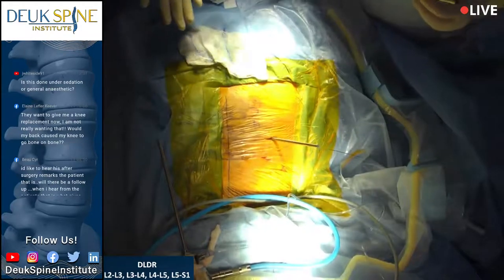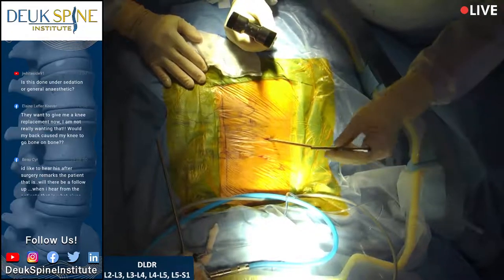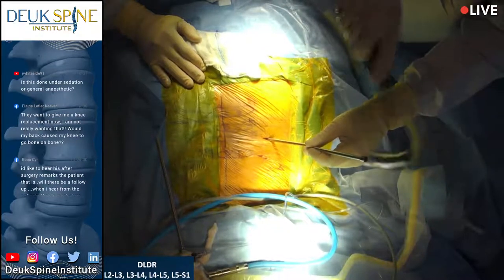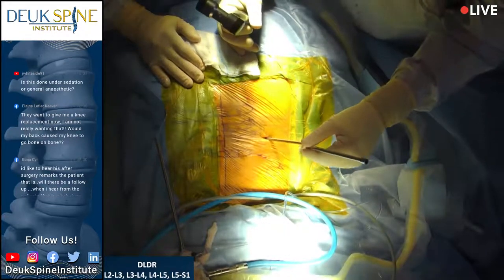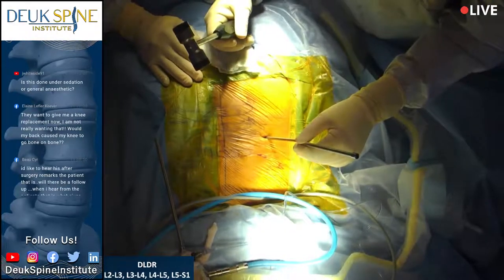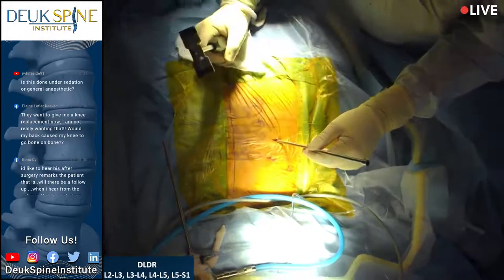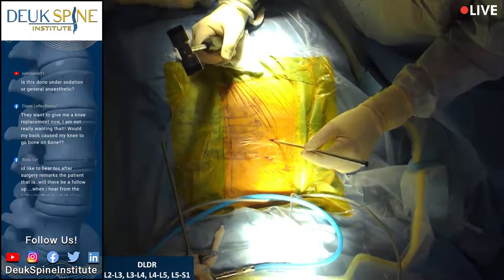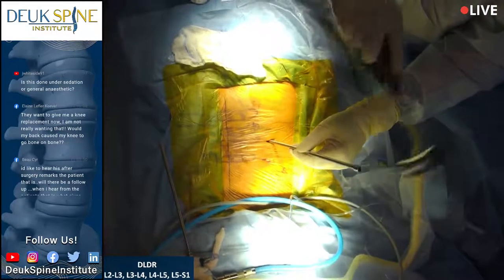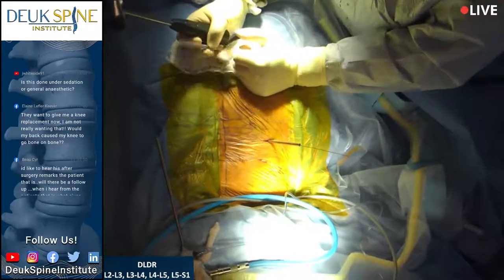Let me have it. Yep. All right, so now we're down here at the level of the facet joints, and I need to get past them and get into the 5-1 disc. Meanwhile, I'm staying in constant communication with my nurse and my anesthesiologist, and they're letting me know how this patient is doing. If at any time we feel it's not safe, we're going to stop, and we're going to have to abort that disc.